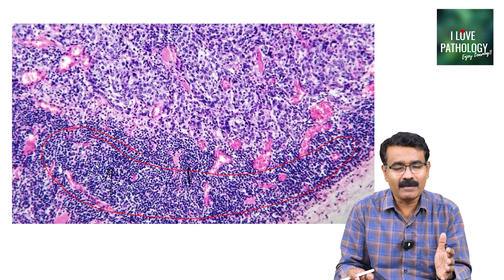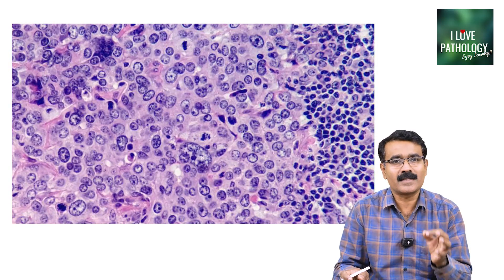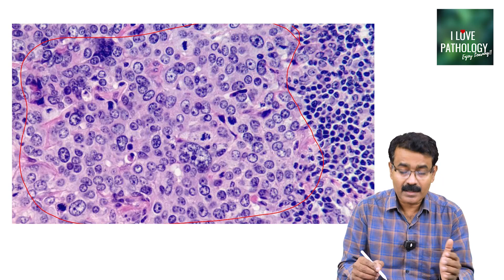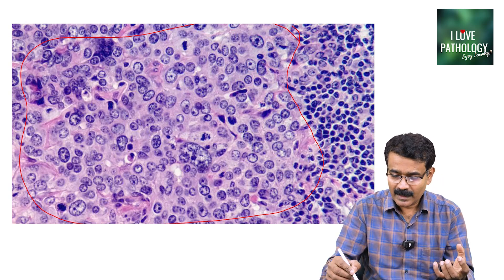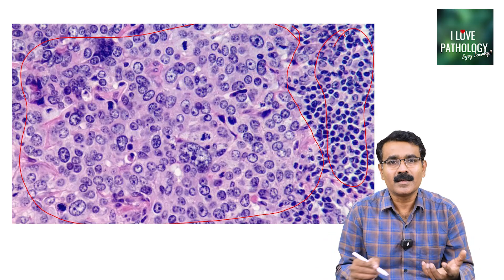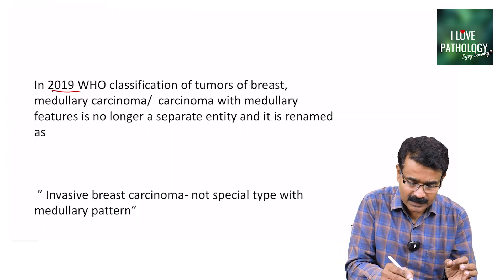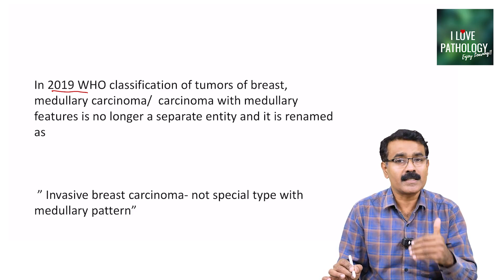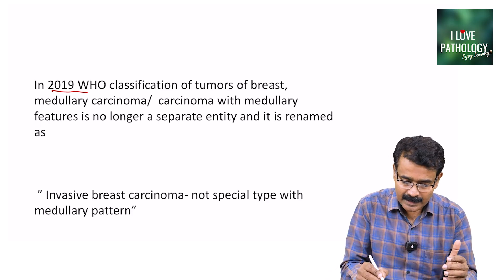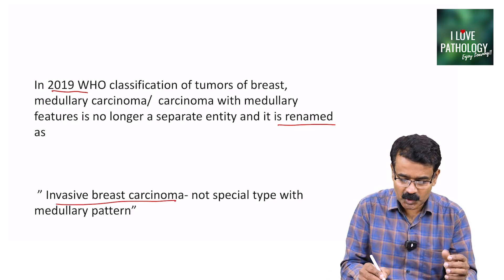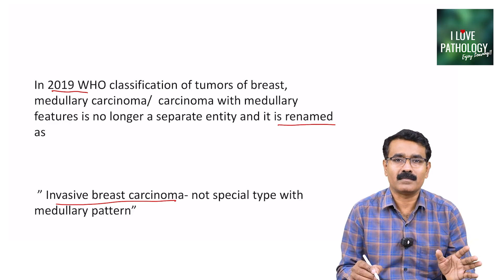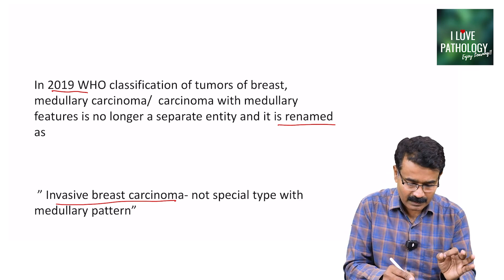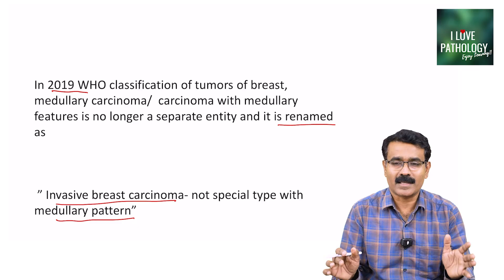This particular type is referred to as infiltrating duct carcinoma, medullary type. These are large polygonal sheets of cells with marked variation in size and shape of the nuclei, surrounded by lymphocytes. In the recent classification of breast tumors, this is no longer referred to as medullary carcinoma — it is renamed as invasive breast carcinoma, not special type, with medullary pattern. Remember, do not call this tumor medullary carcinoma; it is invasive duct carcinoma with medullary pattern.